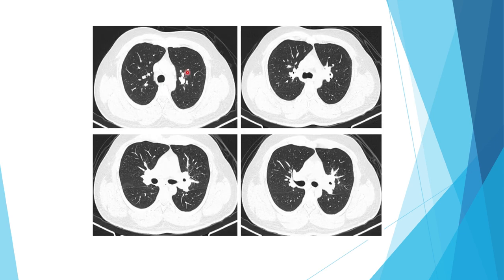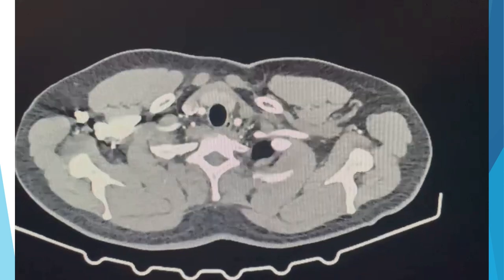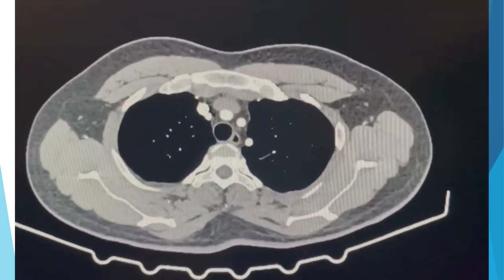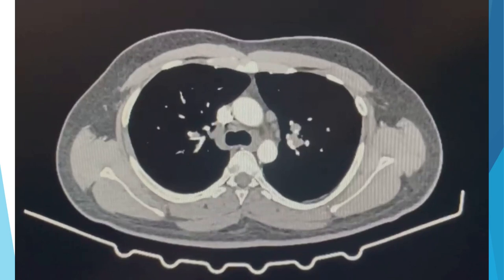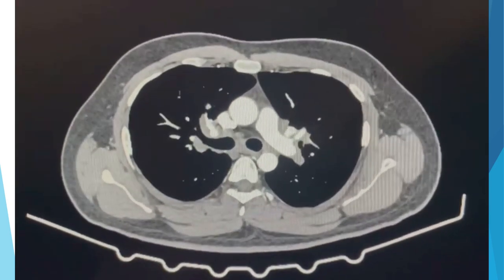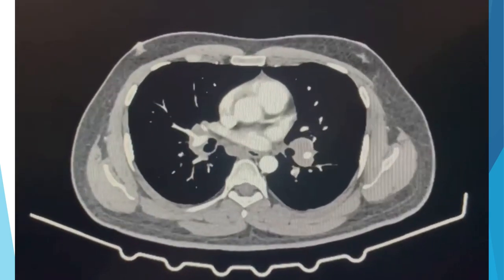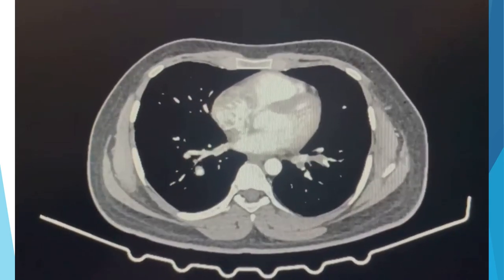The lung parenchymal cuts are grossly normal, with some fissural thickening if you look closely in some areas. Now the video of the CT scan from the apex going down. As we see here, the paratracheal node seems to be much smaller; 4L, 5, you can see the 10R, 11R, 7, 10L, 11L, so all the nodes are there. They seem to be more symmetric, a little bit larger on the right side, and that's about it. So that is in brief about this case.